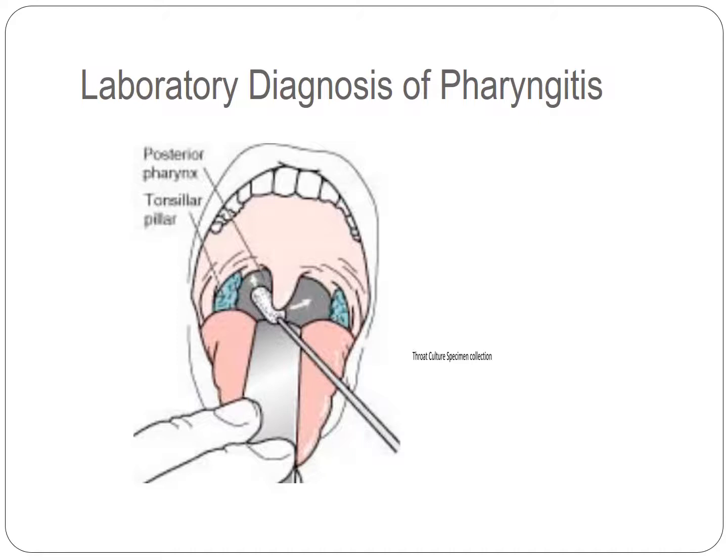Unlike samples from cutaneous infections, direct smear of upper respiratory tract infections is of little value, except for the diagnosis of Vincent's angina. Remember, the direct gram-stain smear is the only method to make a diagnosis.